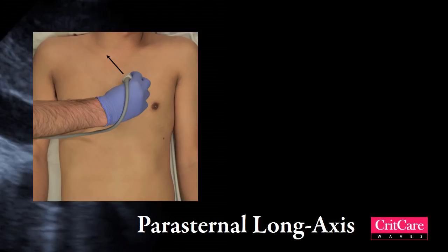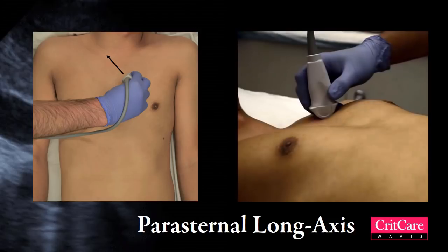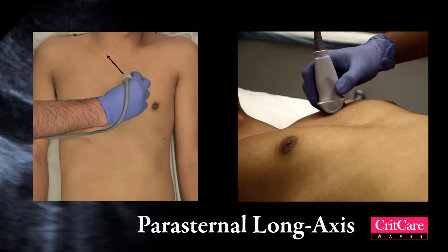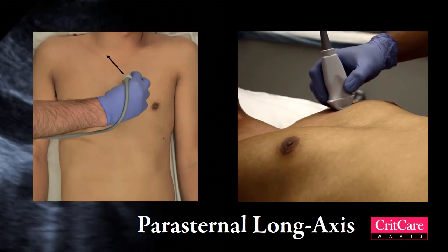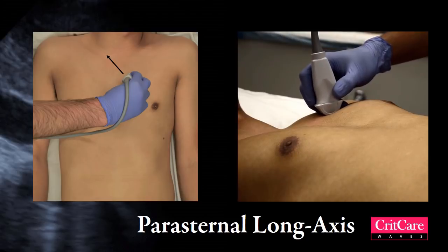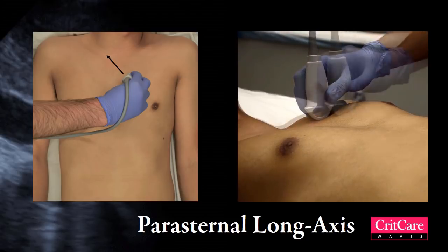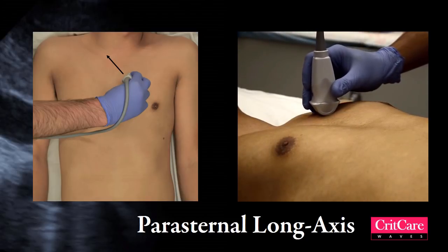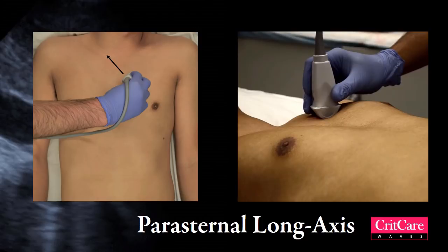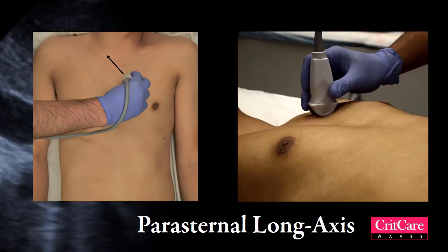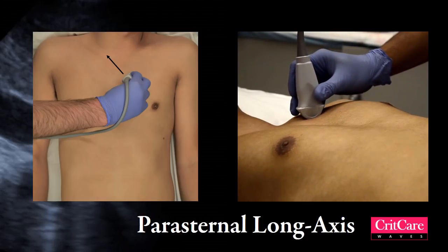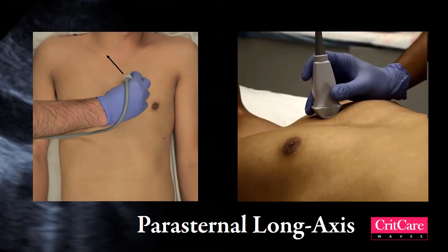Start off by scanning the intercostal space, moving laterally until you see something move at the frequency of the heart rate. If you are not getting a view, sweep the probe to an intercostal space above or below and scan that intercostal space similarly. Once you see the moving heart partially, use very fine rocking and fanning movements to improve the image.